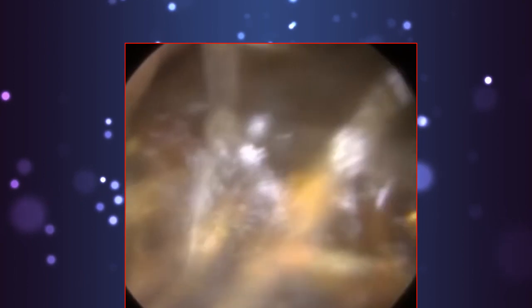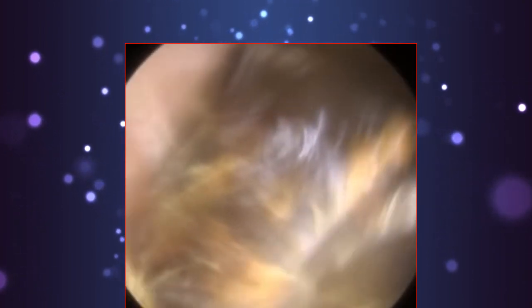Okay, I'm just bringing this forward. So you can see how many hairs are there. It's really matted. Now that I've brought this plug forwards, I'm able to use a hook or other instrumentation to safely remove it. You can see I'm purposely bringing the wax down at the top to create an opening. So I've created that opening, and we know we can put the hook in safely now. We're not going to touch the eardrum, because it's almost blind sometimes when you put the hook in, because you're going to get in behind. Slowly bringing this forwards, and it's come out in a big piece.